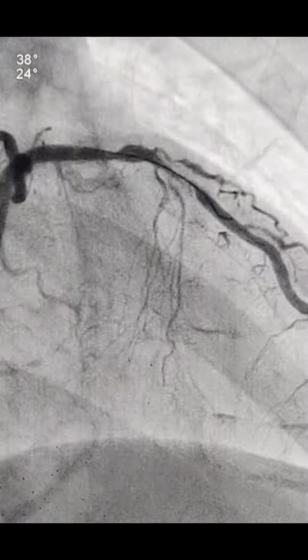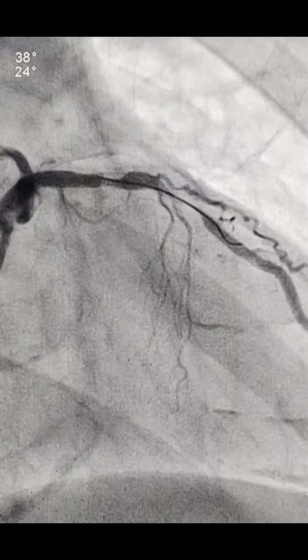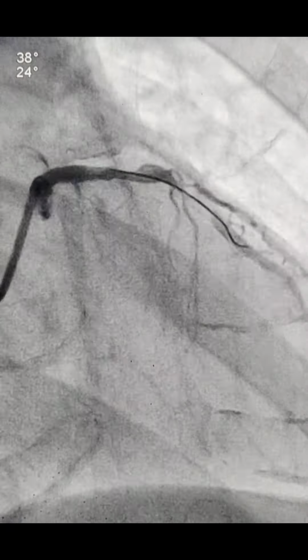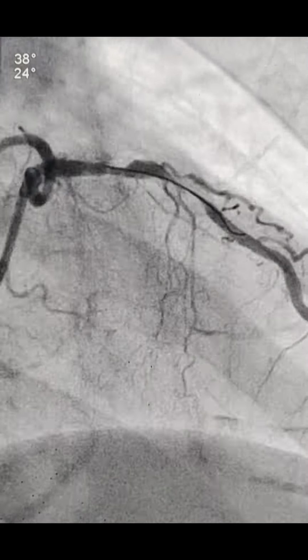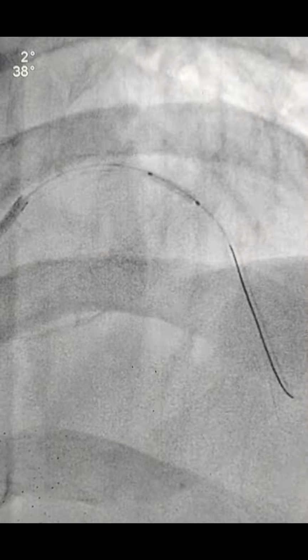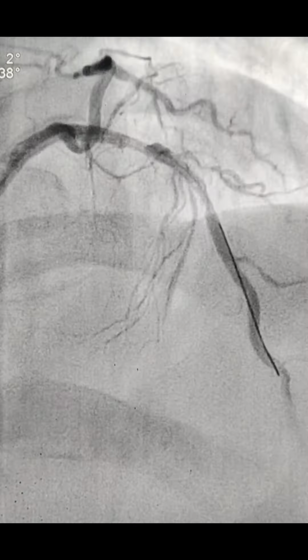And this is the wire shot we have taken with the right radial route. We went ahead with the XB catheter 3.5, 6 French, and this is the guide shot, and we wanted to know the length of the stent. We wanted to do the pre-dilatation, and this is the pre-dilatation because the lesion was very tight. We have to prepare the bed for the stent.